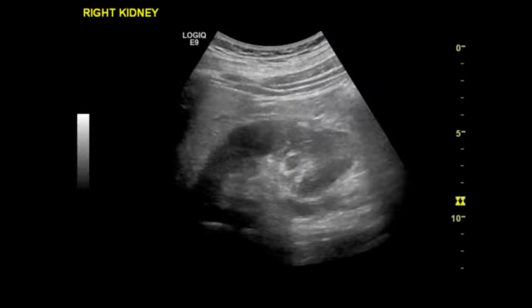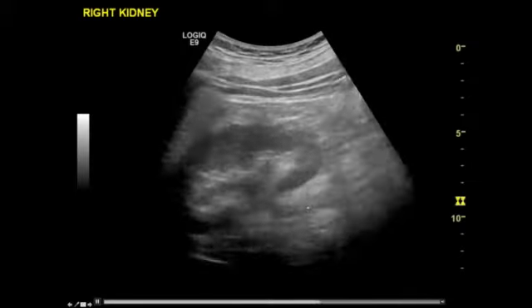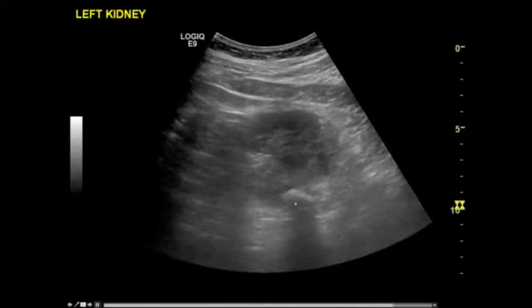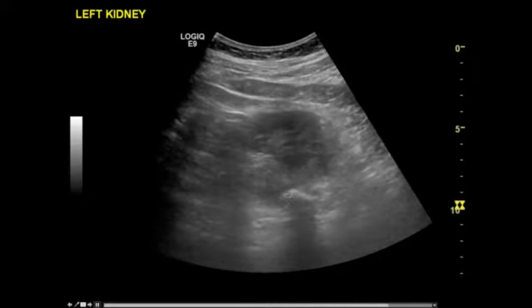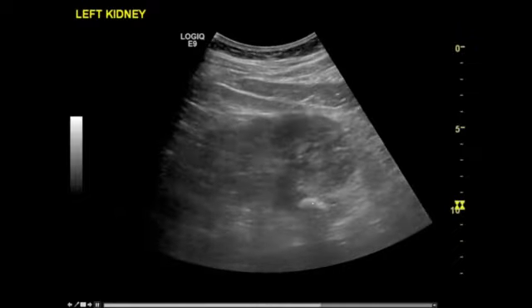So here we have the kidney, and at the top end you can see there is mild hydronephrosis, and here we can certainly see a slightly distended proximal ureter. So normally when it's not distended at all, you wouldn't see it. This time we watch this distended collecting system, and here we see a bright shadow casting lesion. So here we've got this distension, and just here a big kidney stone stuck at the PUJ. It's about 14 millimeters in length when we compare it to the measuring here, and there is that stone. Echogenic, shadow casting, stuck at the PUJ.